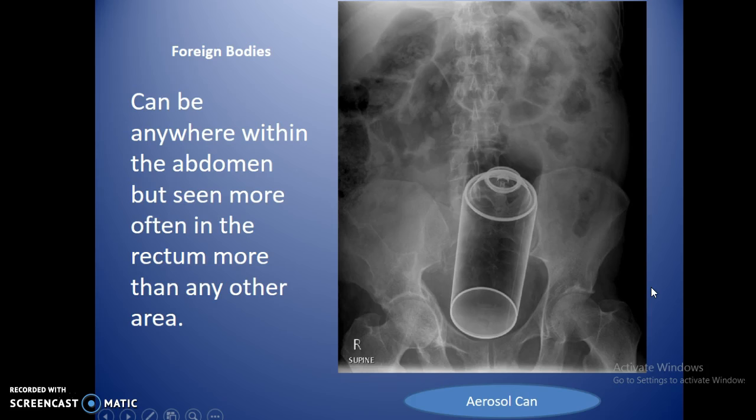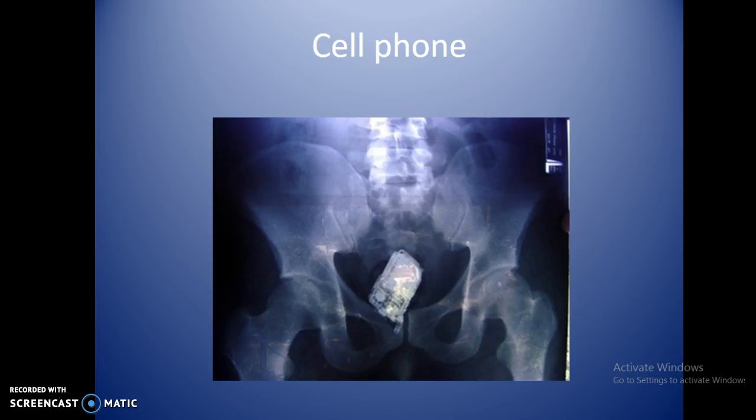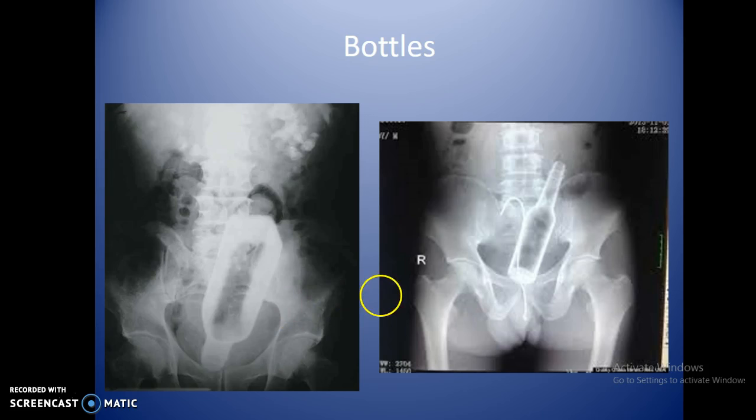Foreign bodies. There's a whole host of foreign bodies on here that you can look at. Patients get some abdomen pain by putting some things up their rectum. So for some reason, it always seems to head to the emergency room at some point. Cell phones are popular. Bottles. This patient's got a little hook. It looks like they got stuck here because it looks like they went fishing for the bottle, so occasionally you'll see other things in there as well.